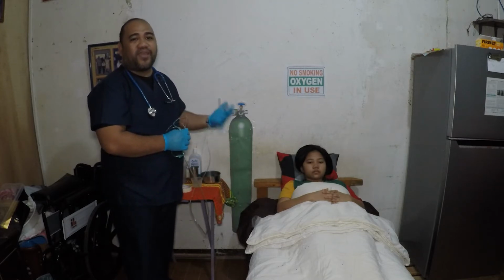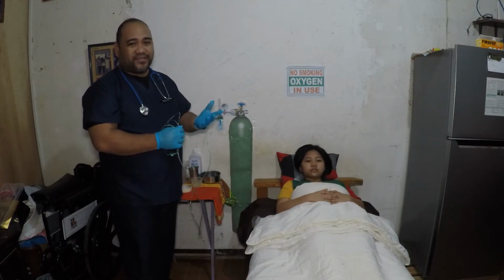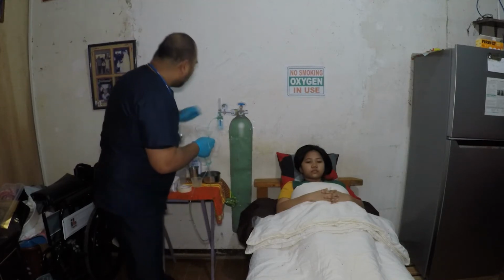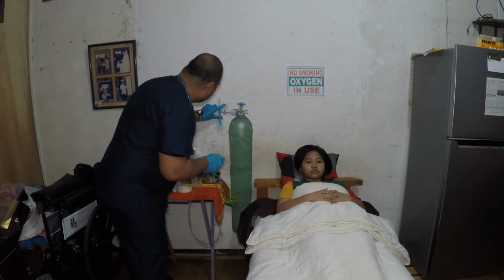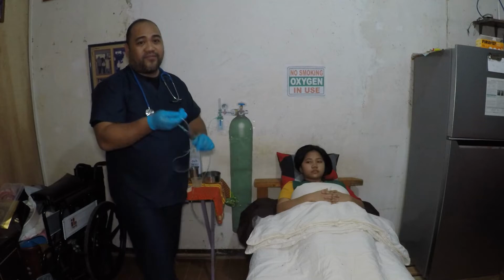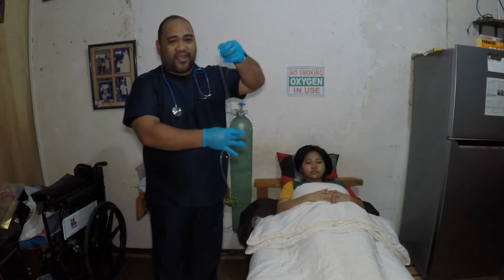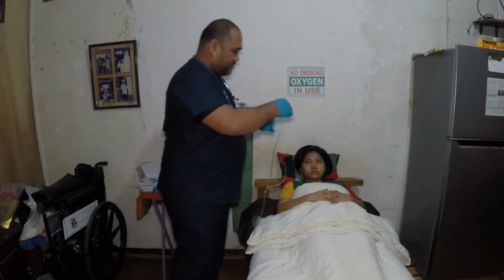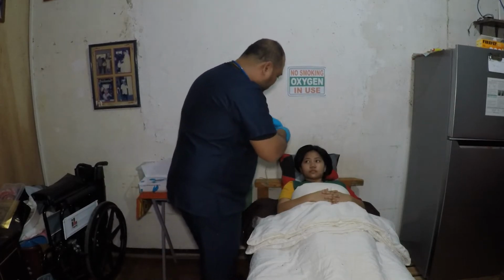A high rate may cause excess drying of nasal mucus, so you have to really check what is in the client's order, the doctor's order in the chart. Okay, so you have to adjust. And then we will now insert the nasal cannula into the client's nostrils. I'm going to insert this in the nostrils.